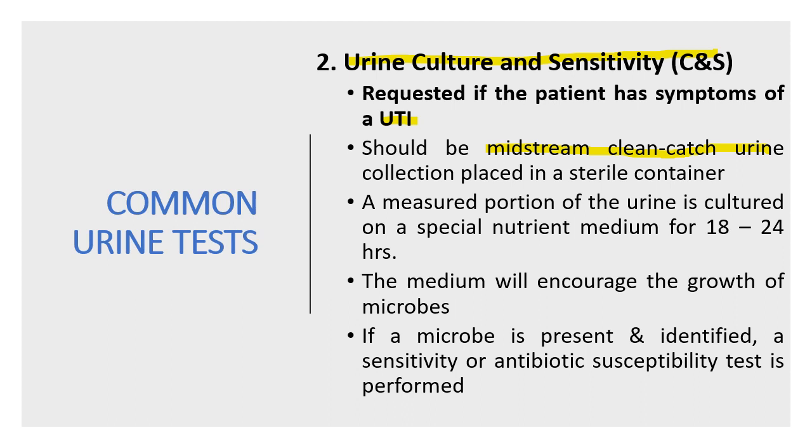Tapos kinukulture siya within 18 to 24 hours. So the medium will encourage the growth of microbes. Tapos pag microbe is present and identified, dun mo na siya isa-sensitivity or antibiotic susceptibility test.